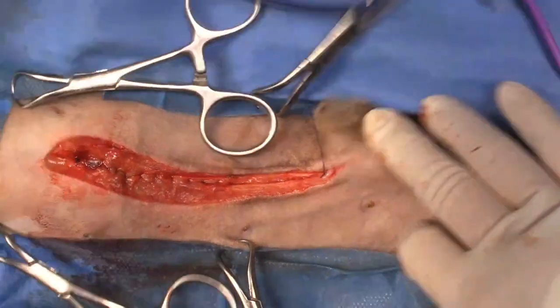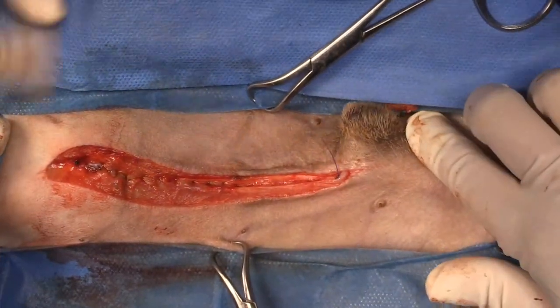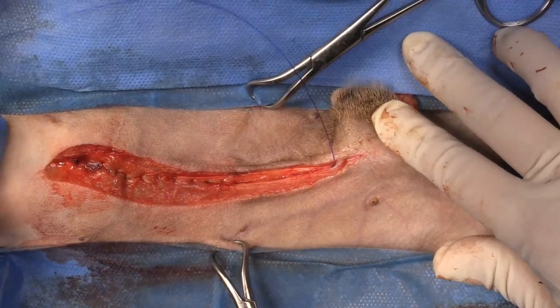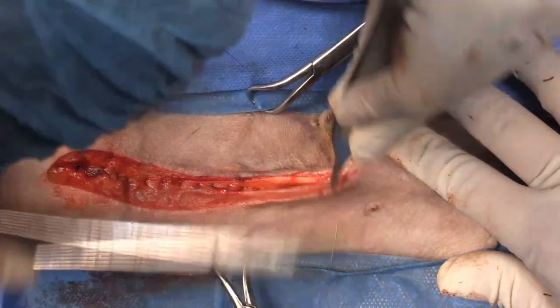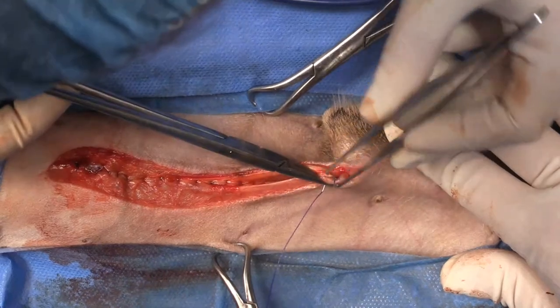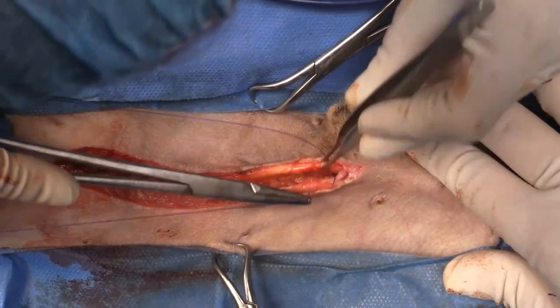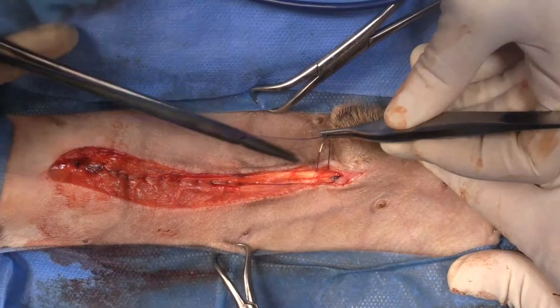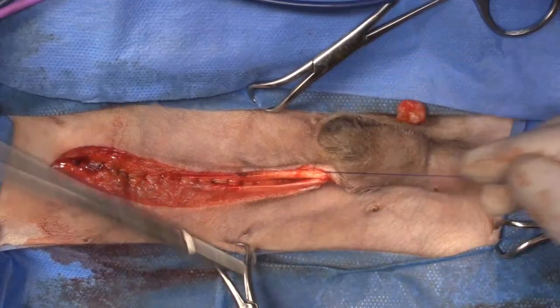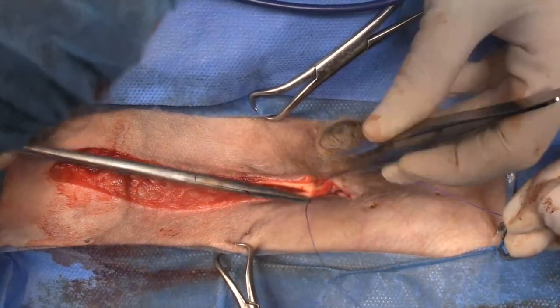The question about, is there a stepwise approach to find the shunt intraoperatively? That's a really good question. The way that I usually do it is there should not be any vessels going into the vena cava cranial to the right renal vein, except for the phrenic-abdominal vein, which is tiny. So if you see anything that's entering the vena cava between the hepatic veins and the right renal vein, that is likely to be the shunt. And so often what I'll do is I'll look in that region, see if anything's coming in, and then also we will make a hole in the greater leaf of the omentum to look down close to the epiploic foramen, which is the other place that you can find shunts commonly.